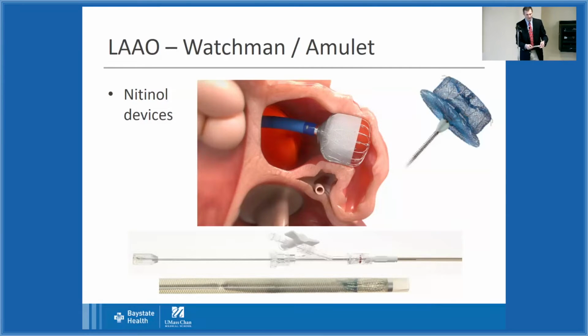So we're going to take a break for half a second, and I'm going to do a magic trick for you. And folks, see this? This is a copper wire. Here's my magic trick. It's a bent copper wire. I'll be here all day for questions afterward. Okay, this is a nitinol wire. Okay, ready? Wait a minute, I can do it.